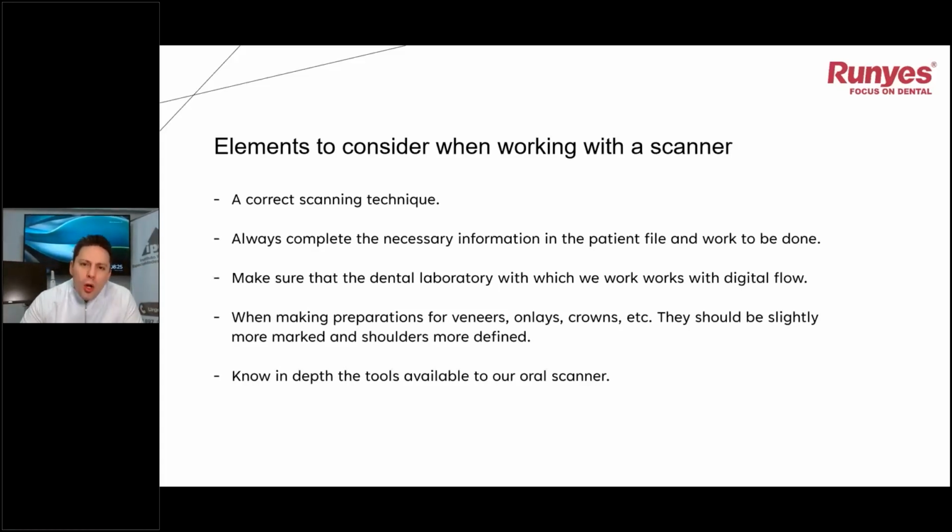And always know the depth, knowing all the tools that our scanner provides us. We have to know our scanner. We have to know what it can do for us, so we can squeeze 100% of all the tools that our scanner has for us, and we can use it in our dental office to explain to the patients, or create a health report, or do aligners or implant cases or restoration cases.